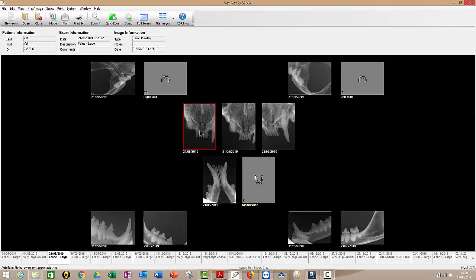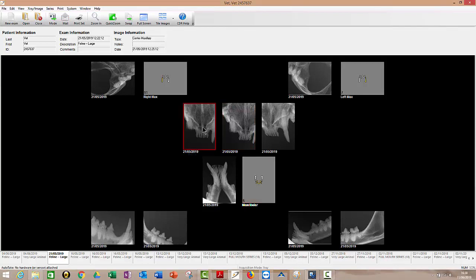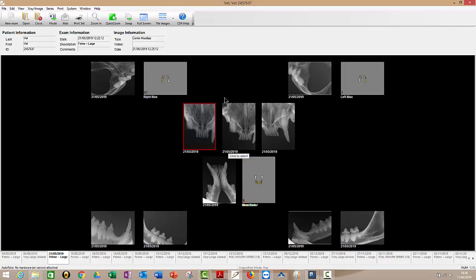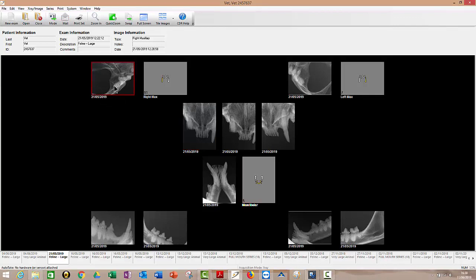So on the upper, this image, well, this image here for the incisors has taken about 45 degrees to the sensor. And then what you do is you just go slightly around the corner as if you're pointing slightly back to the nose and go slightly higher up to get the canine on both sides. And then you move the sensor slightly further back in the mouth and slightly over to the side. And then you're firing pretty much through the eye at about 45, 50 degrees to get these kind of images.